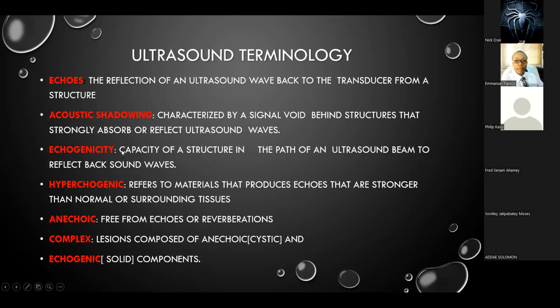Now, echogenicity. Echogenicity refers to the capacity of a structure in the path of an ultrasound beam to reflect back sound waves. So we would say that it is highly echogenic or not very echogenic. When you say it is of high echogenicity, it means that it is able to reflect more sound waves back.